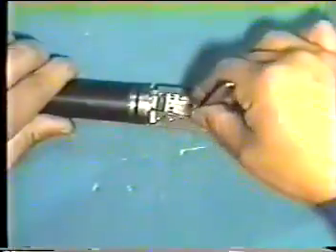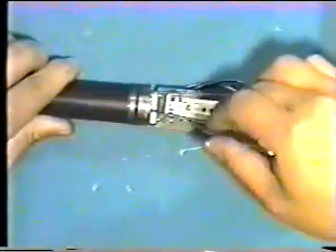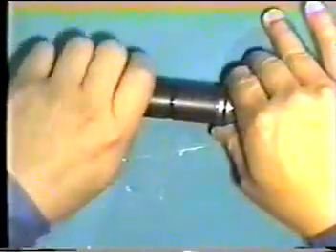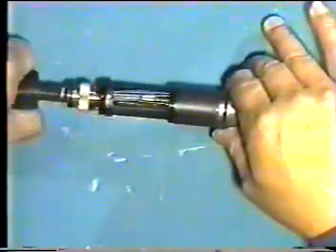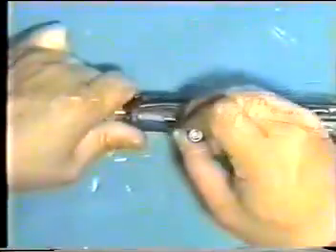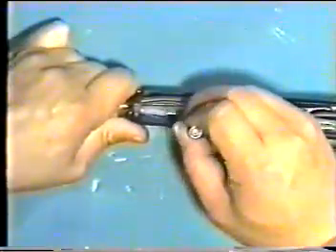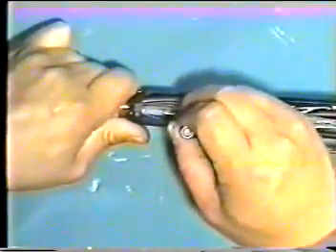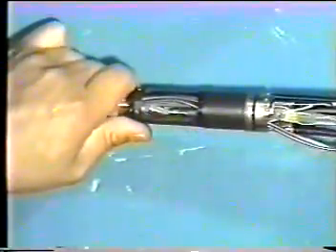Disassemble 4 sleeves from the guide to release angulation wires. Take care not to have wires folded up. Remove the cover rubber from the FSA, that is IG flexible section. Loosen the ring which secures the FCT, that is the forceps channel tube.